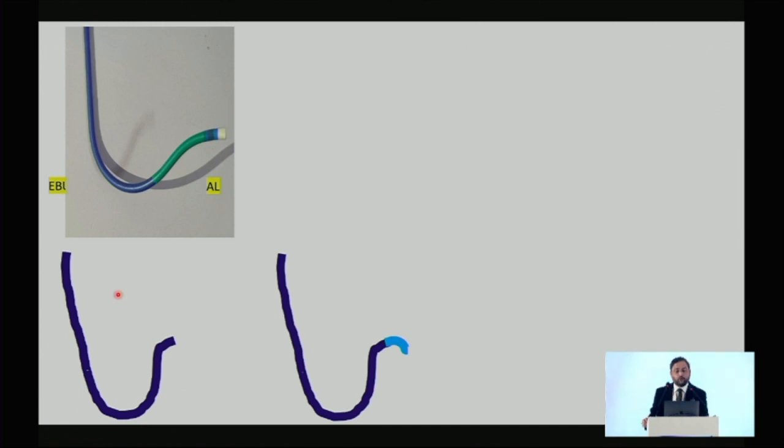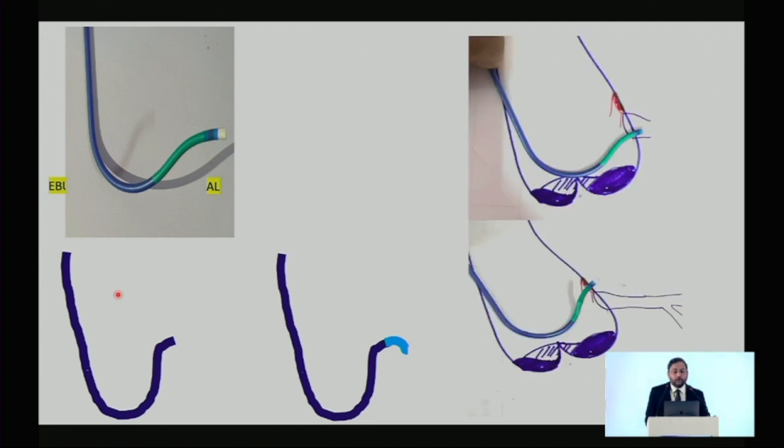What you really have to do is dip it in hot boiling water, give this curve, put it in cold water, again put it in hot water, give a curve which is of course 90 degrees forward bent here, and by dipping it in boiling water, you make the catheter more malleable. You are able to give that curve and engage the superiorly and anteriorly looking coronary arteries.